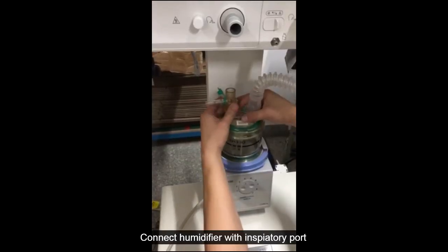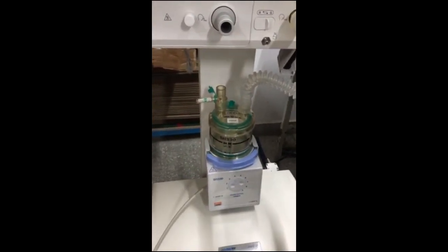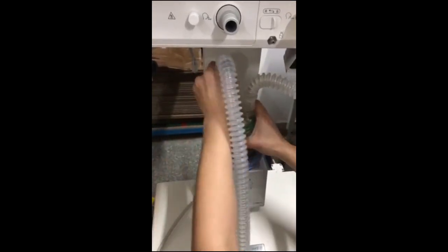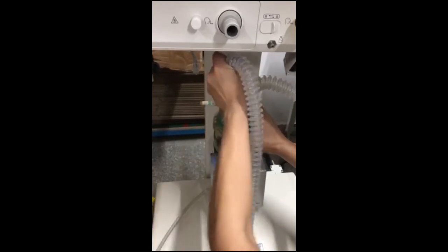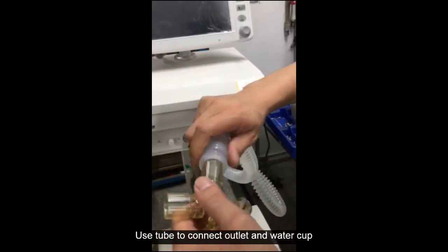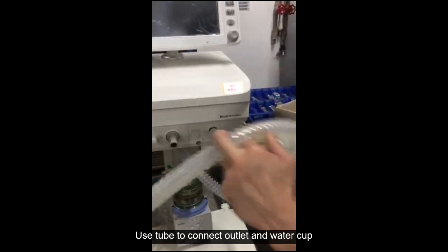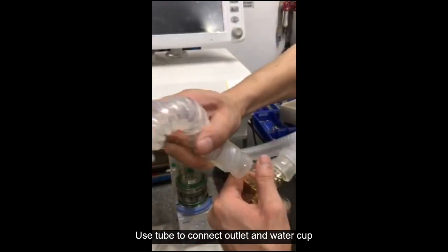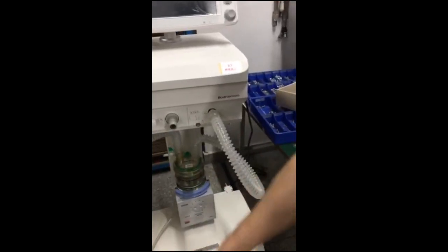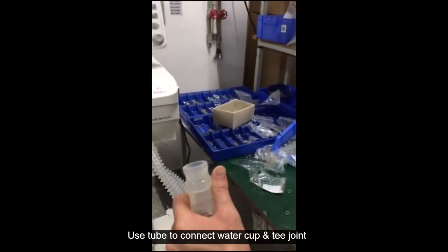Connect the humidifier with the inspiratory port. Use the tubing to connect the outlet and water cup, then use another section to connect the water cup and T joint.